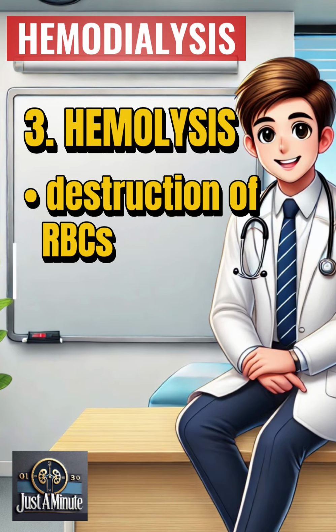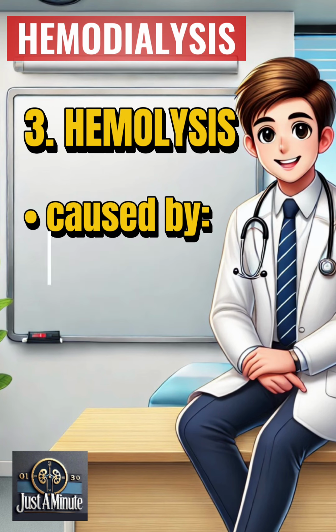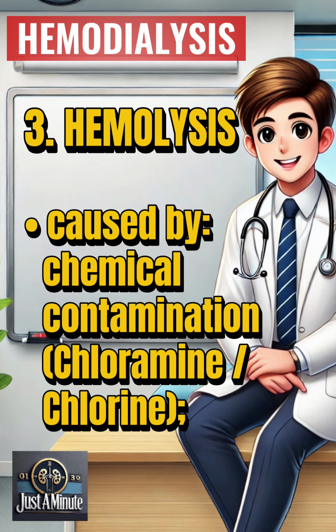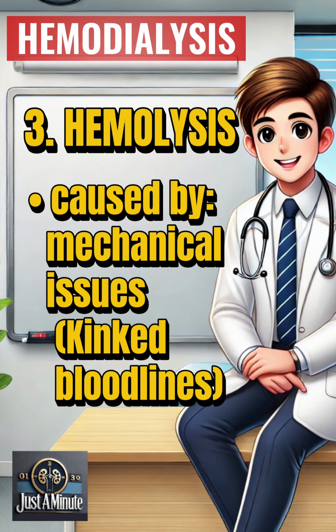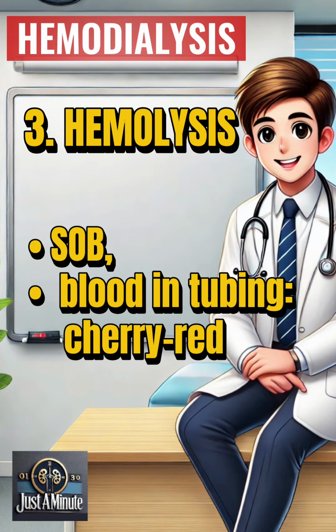Hemolysis refers to the destruction of red blood cells during hemodialysis. It may be caused by overheated dialysate, hypotonic dialysate, chemical contamination such as chloramine or chlorine, or mechanical issues like kinked blood lines. Clinically, patients may complain of chest or back pain, shortness of breath, and the blood in the tubing may appear cherry red.